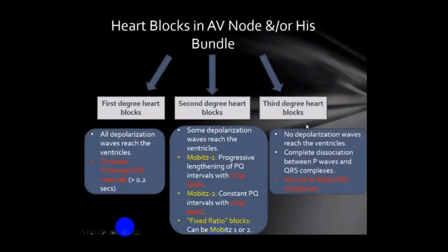We'll show you that. While in a case of complete heart block, the P wave is independent, the QRS complex is independent. So there is depolarization of the atrium by the SA node, but the ventricle is depolarized because of a ventricular focus, which is not controlled by the AV node or SA node, because the impulse from the atrium cannot be transmitted to the ventricle because there is a complete block at the level of the AV node. That's why the P wave is independent, the QRS complex is independent. Atrial rate is faster because it is the SA node rate. It will be between 60 to 100 per minute, while the ventricular rate will be an idioventricular rate, which will be between 20 to 40. Hence, P waves will be more, QRS complexes will be less.